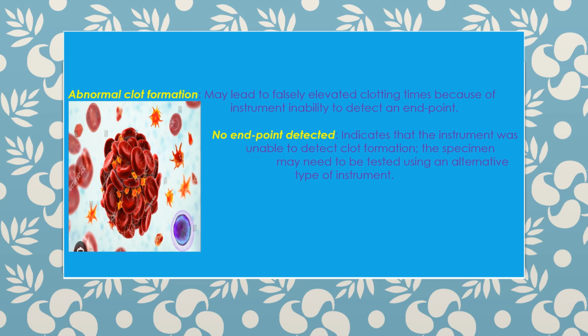Lastly but not the least, no endpoint detected indicates that the instrument was unable to detect clot formation. The specimen may need to be tested using an alternative type of instrument.